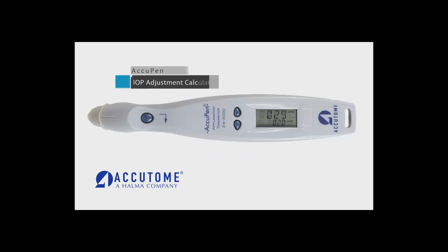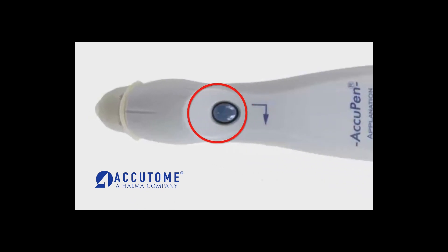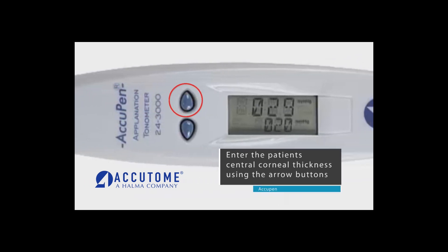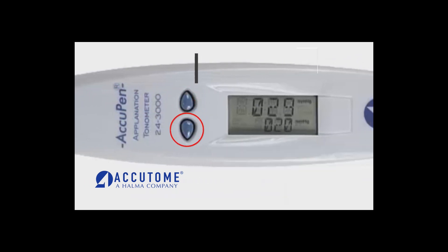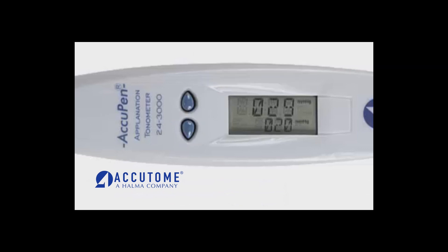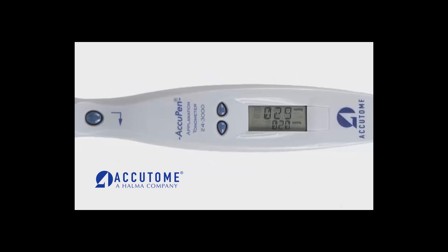The AccuPen also has an IOP adjustment calculator. Hold down the action button for three seconds to enter the IOP adjustment mode. Enter the patient's central corneal thickness by using the arrow buttons to scroll up or down. Press and hold to increase or decrease thickness by increments of 10. It is important to note the AccuPen does not take corneal thickness measurements.